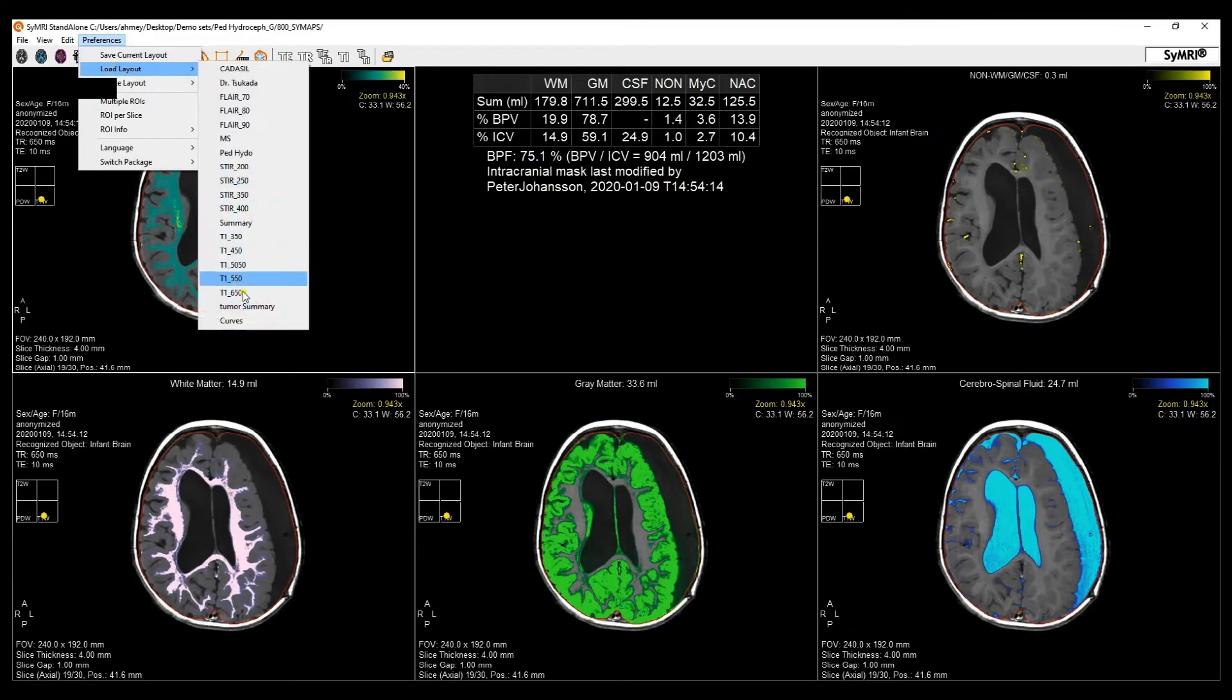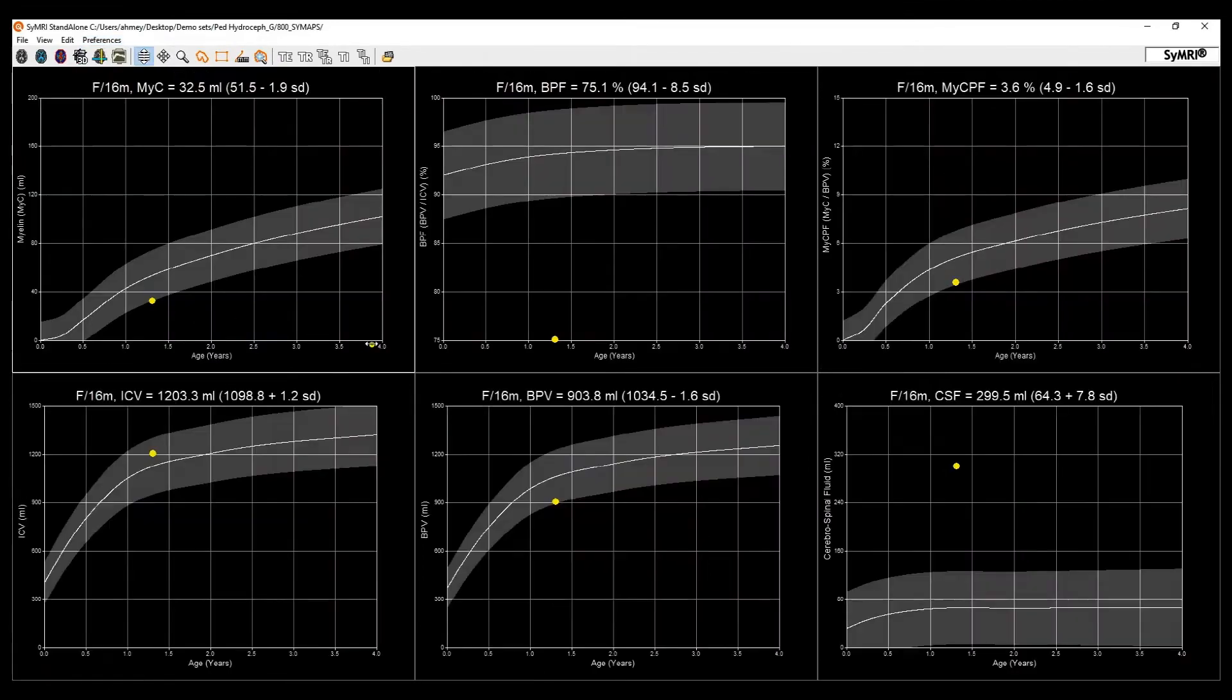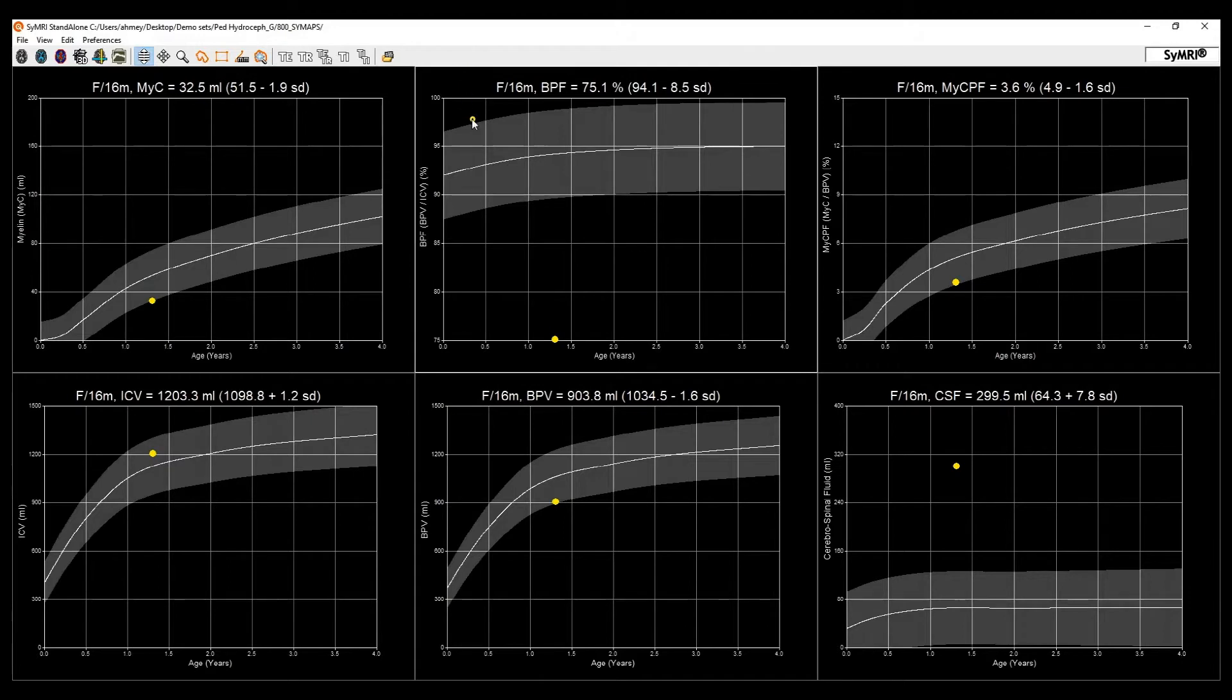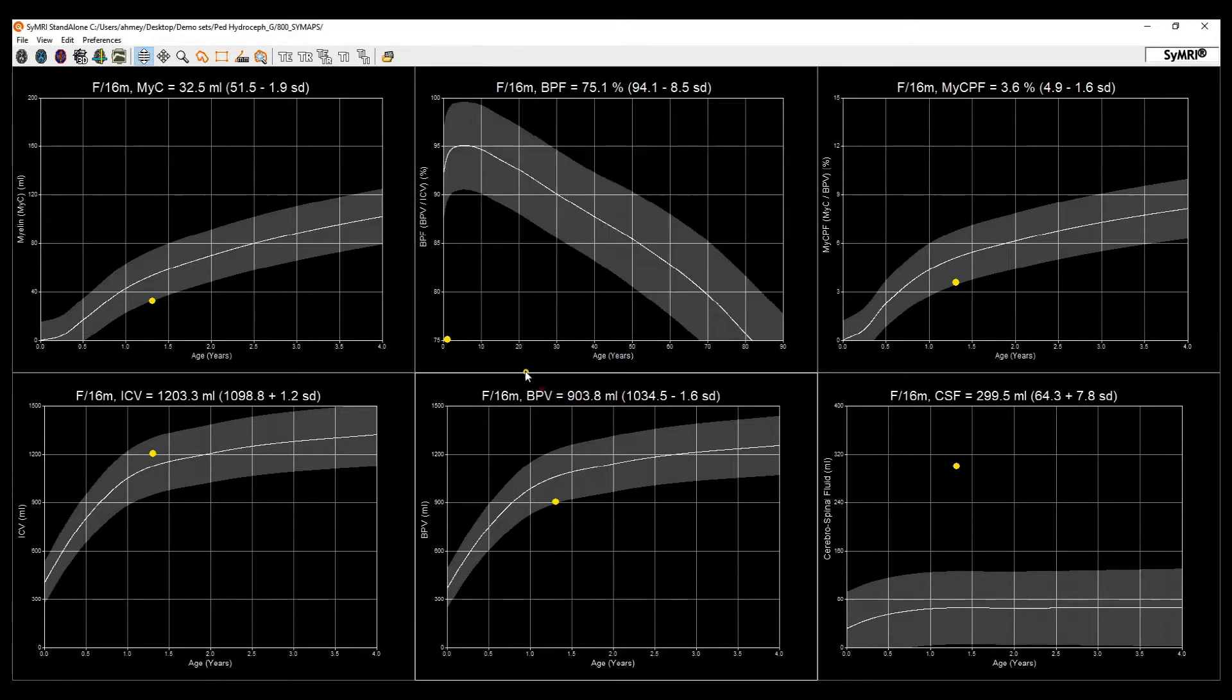Over here we have all of our reference curves. As you can see, they are all age stratified with the ability to expand the age range all the way up to 90 years old.